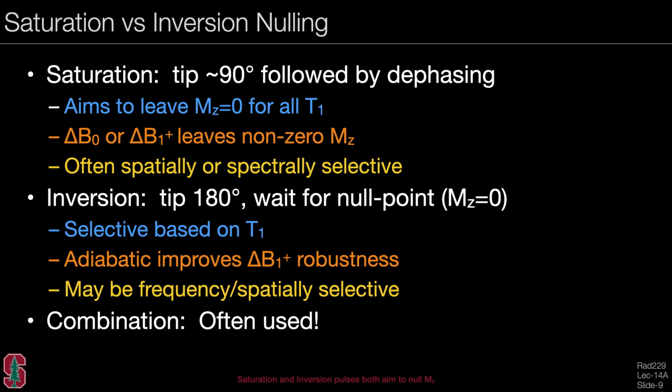So we might play an inversion pulse followed by a dephaser, for example. Also, because the flip angles may vary, we often want to play the dephaser regardless, and sometimes we will over-tip the 90-degree pulse as well.